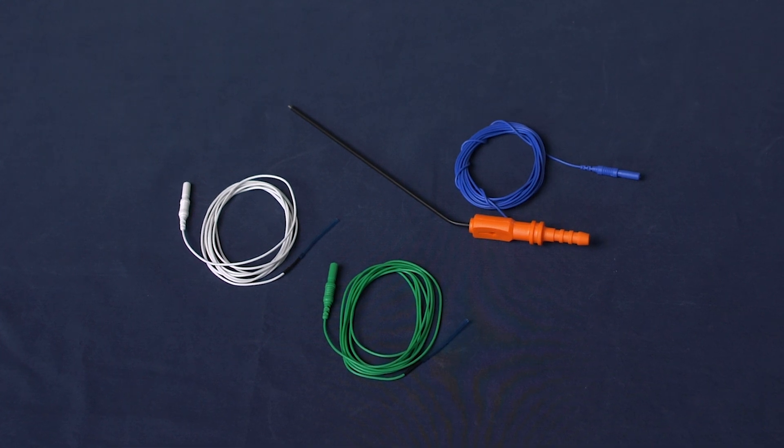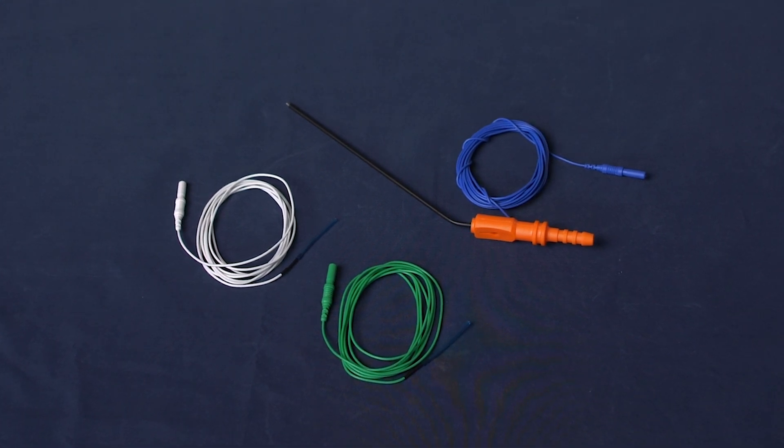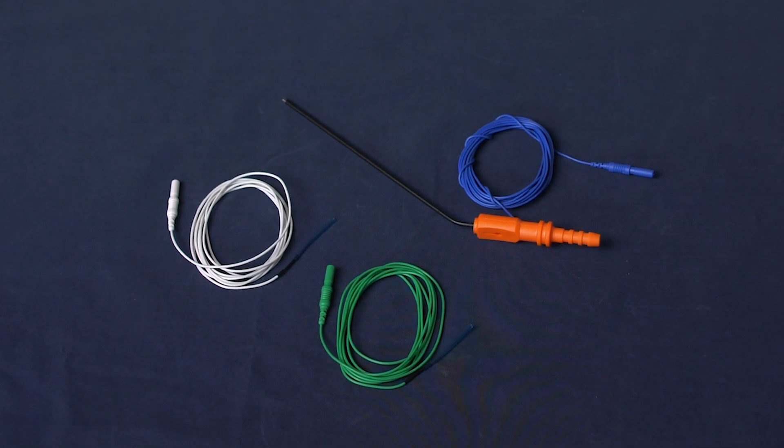Follow your standard OR and neuromonitoring protocols for needle handling, placement, and securing to the patient. If you are handling the needles before the clinician inserts them in the patient, do not remove the needle sheaths unless and until directed by that clinician to do so.